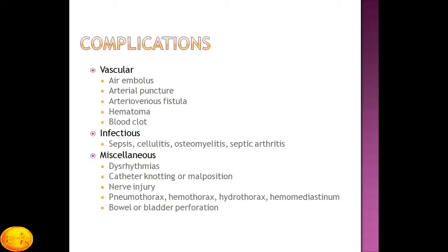Then some miscellaneous complications: while putting the guide wire and the central venous catheter, dysrhythmia can occur. The catheter can be misplaced and get kinked, so you cannot measure the pressure, and you cannot give the drugs as well. Then pneumothorax, as you are doing it blindly into the cavity, can occur. So it is a protocol that you should take an X-ray after doing central venous or pulmonary artery catheterization. You should take the X-ray after 2 hours.